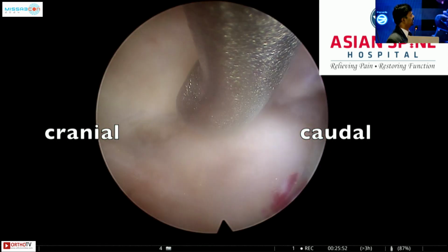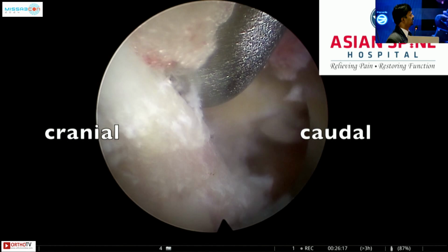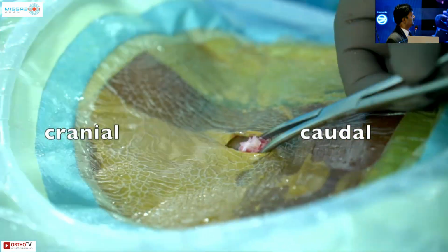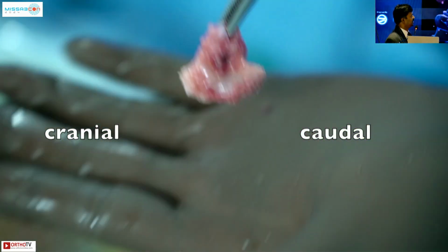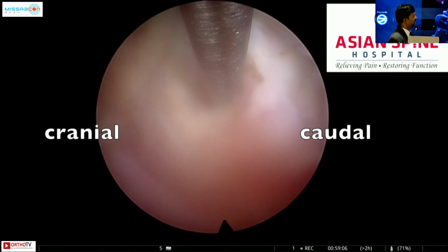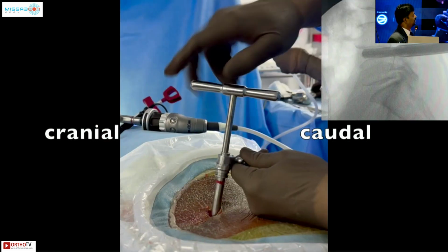So you can see I'm just checking whether it is attached anywhere. It's not attached, it's floating now. So I just grab it with a tooth punch. You can see I just came out from the subcutaneous space. With the same 10 mm incision, you can remove the graft, roughly about this size. Once it is removed, rotate the sheath and then just use a chisel to open the window.